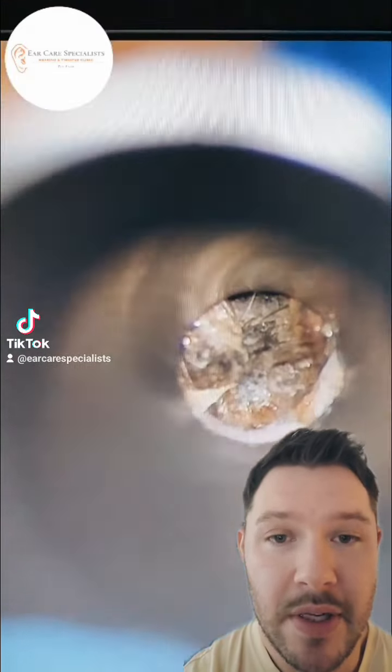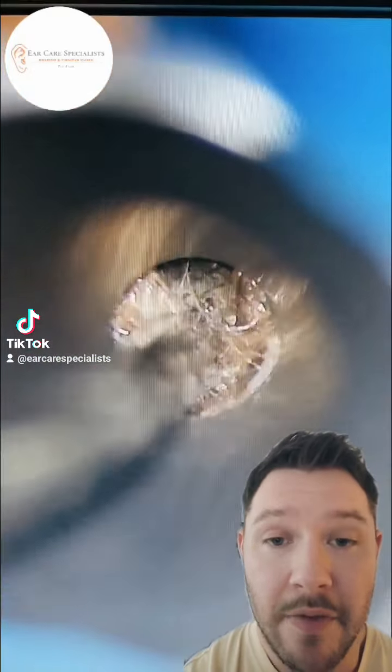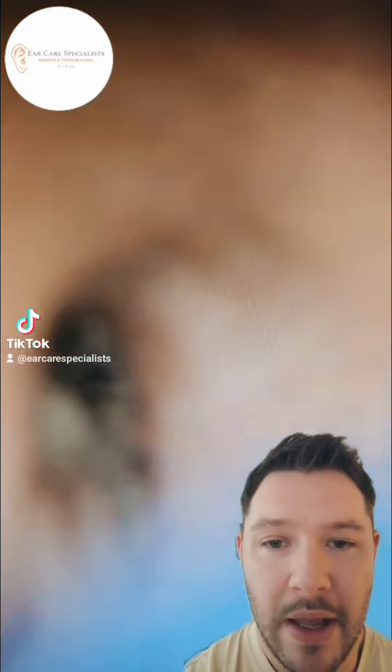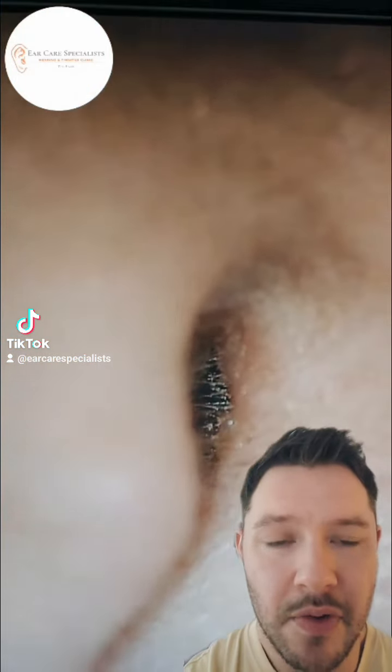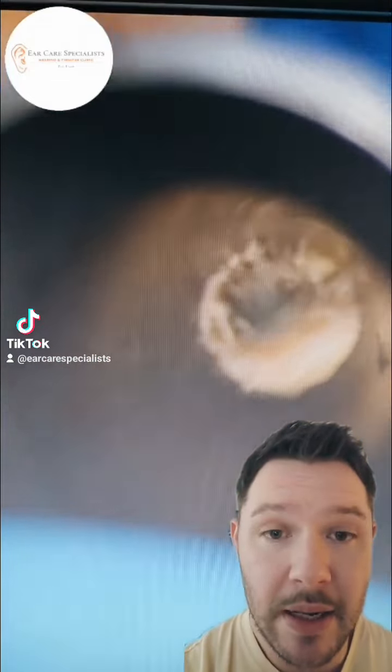It's causing hearing loss, as it often can when it's fully occluded in there, and it's just not very nice having it in the ear. I've got this on 12.5x magnification because the ear canals are very, very small, and you see straight away this first plug of wax comes out. It doesn't look huge there, but actually it's enough to block the ear off, so once that comes out they notice an improvement in their hearing immediately.